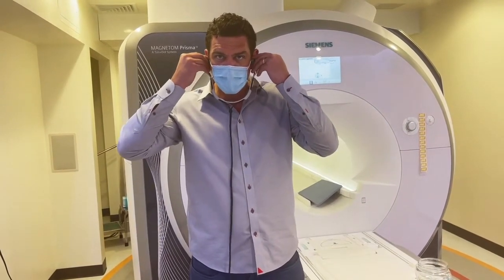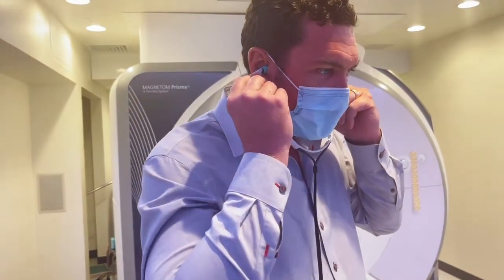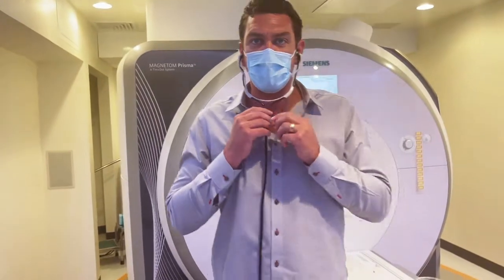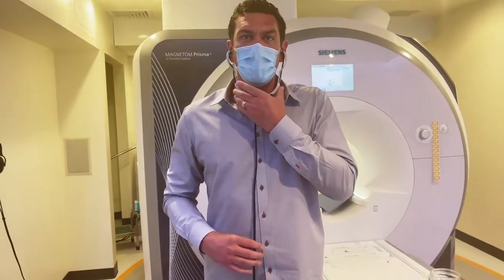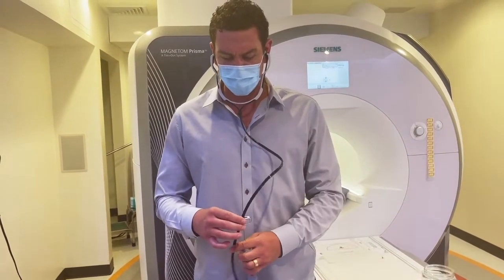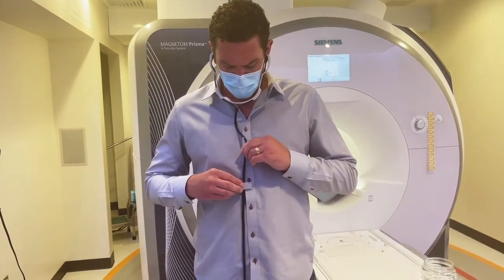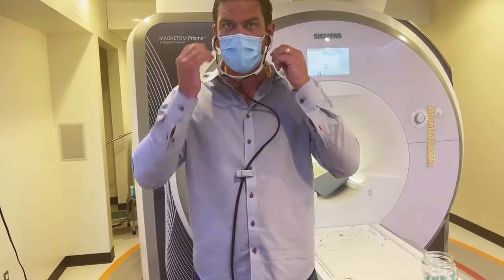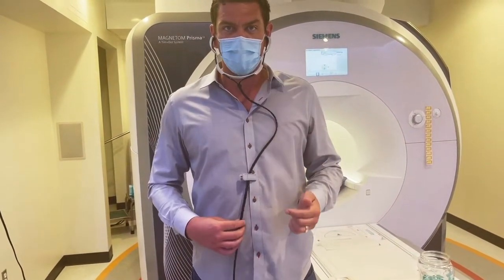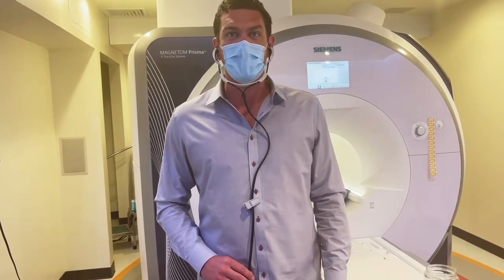Insert them in the patient's ears — you want to get them deep in the patient's ear canal to provide proper hearing protection. The stethoscope apparatus will also help keep them in place. Additionally, there is a garment clip that you want to attach to the patient. Leave a few inches of slack between the headphones and the garment clip so that when the patient is loaded into the table, the garment clip relieves the stress and prevents the headphones from getting yanked out of their ears.